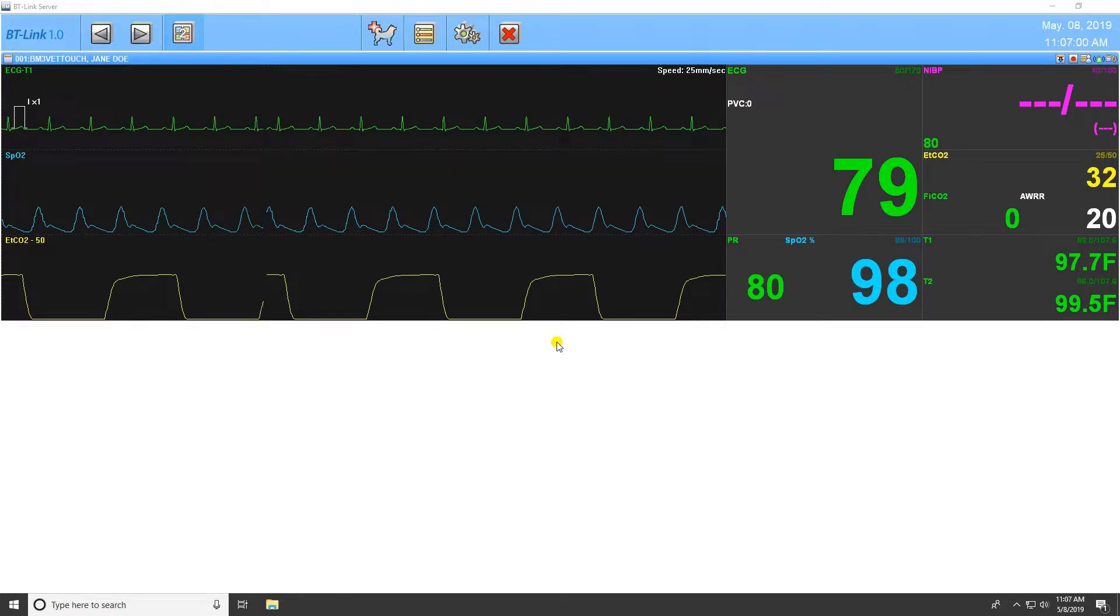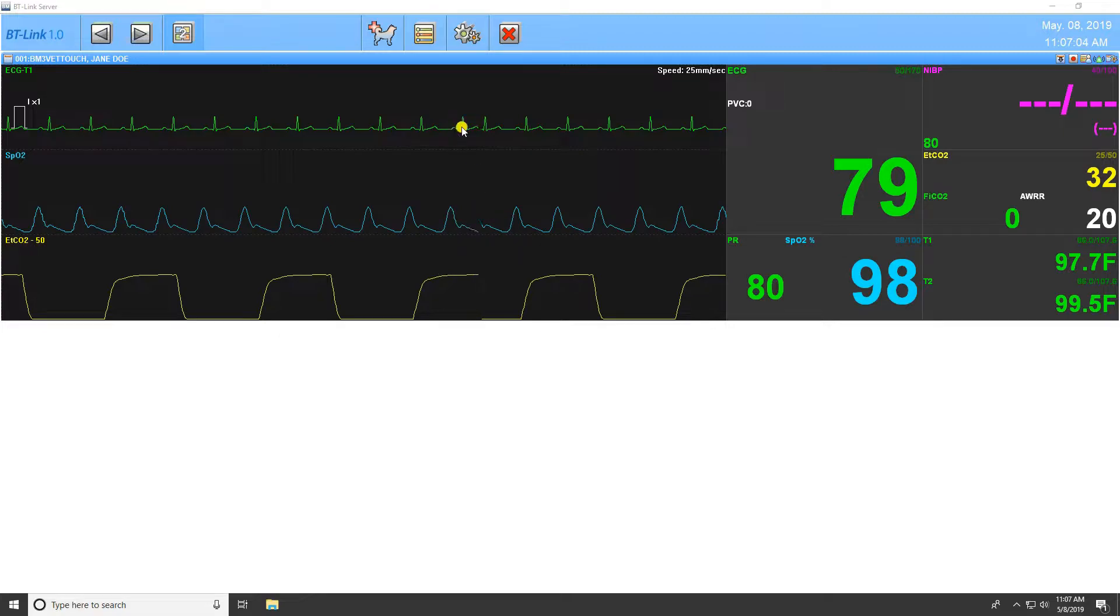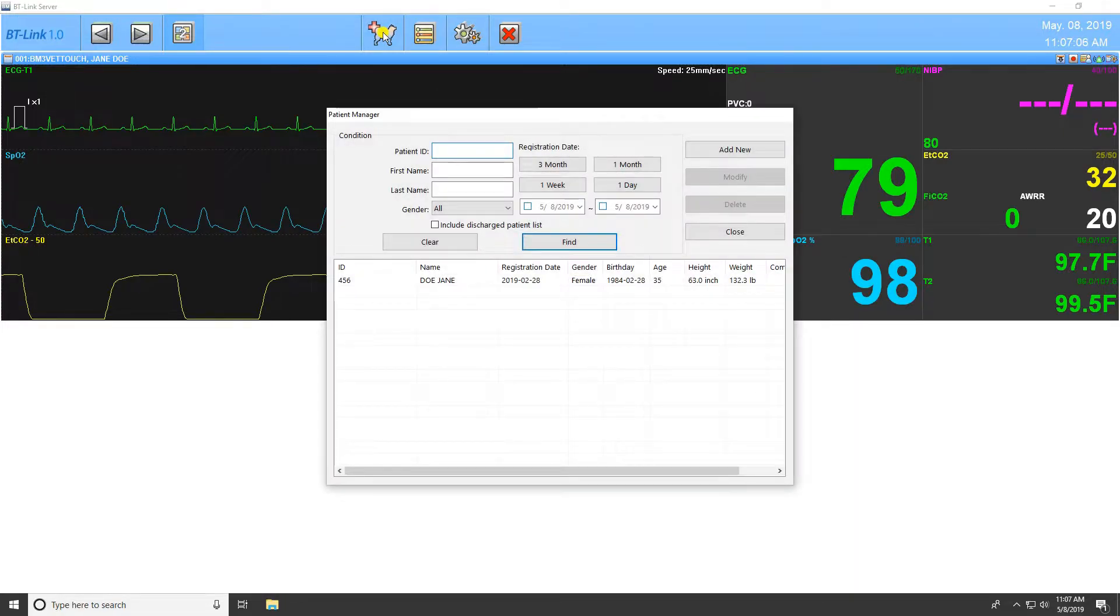In this video, we will explore the various functions and settings that the BT-Link program has to offer. Click on this button to launch the Patient Manager.